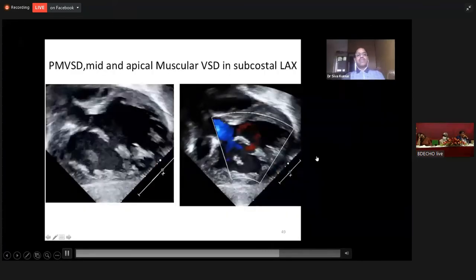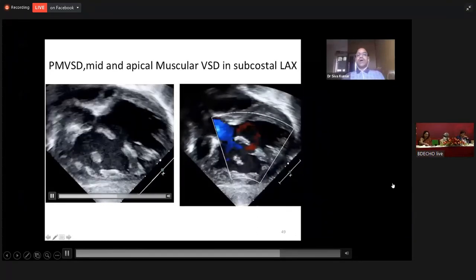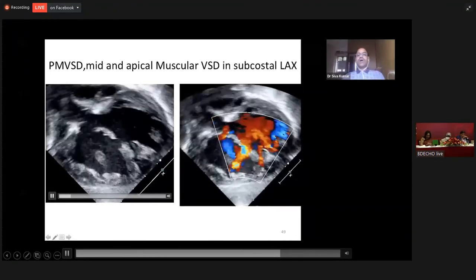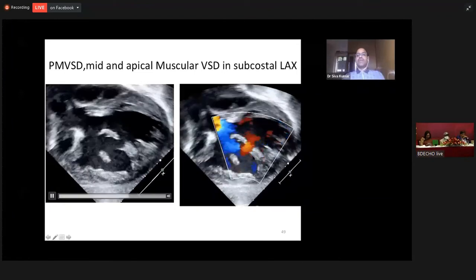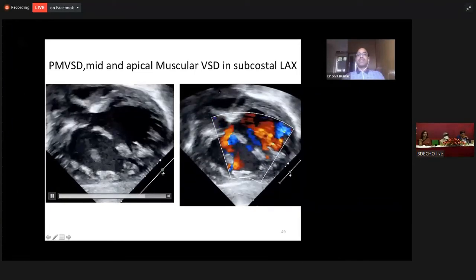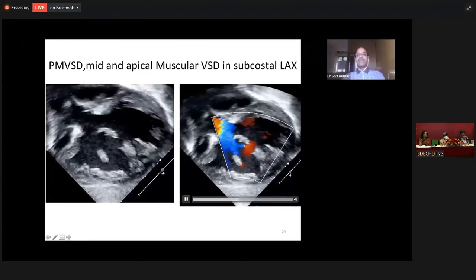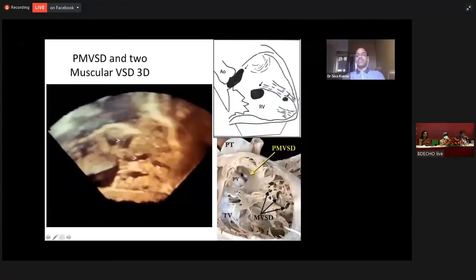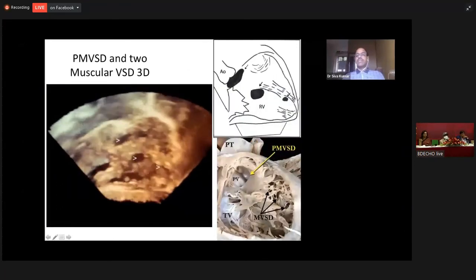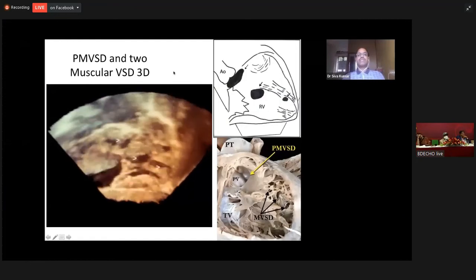Sometimes VSDs can be multiple. This is a perimembranous VSD, mid-muscular VSD, and apical muscular VSD — all three VSDs are seen here. This can also be appreciated on a three-dimensional en-face view. The example is drawn on cartoon and shown on the specimen: a perimembranous VSD and multiple muscular VSDs — mid-muscular, apical muscular, and perimembranous VSD.